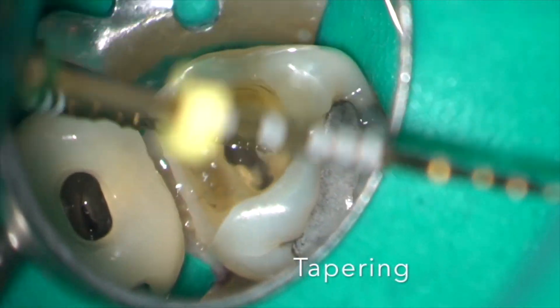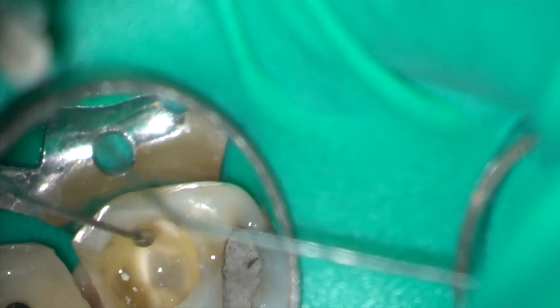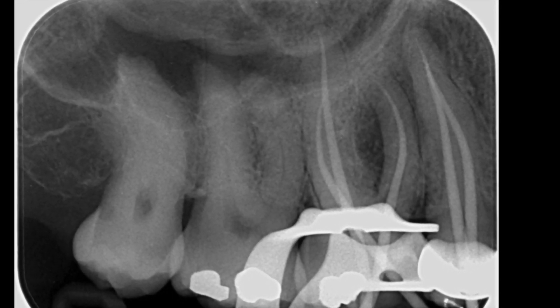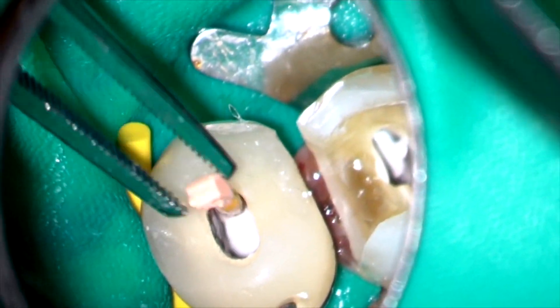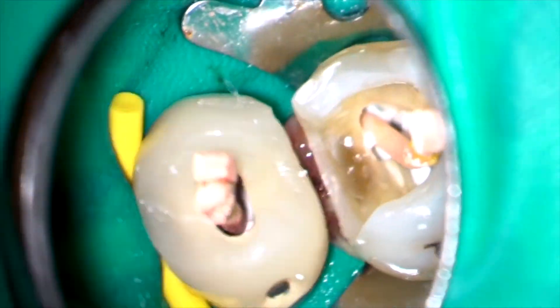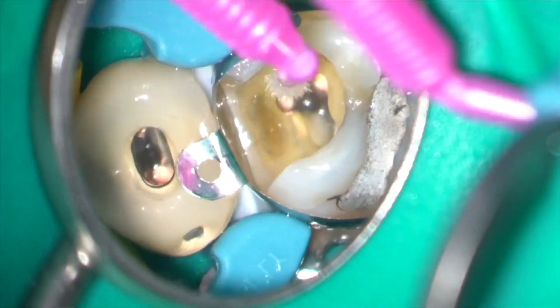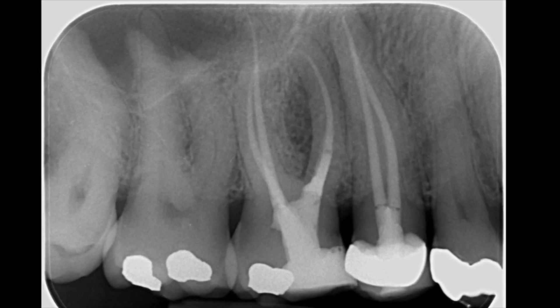This sequence has been speeded up. A cone fit radiograph was exposed prior to obturation using a bioceramic cement and single cone technique. The access cavity was sealed using a dual-cure composite and the palodent matrix system. The final radiograph shows excellent coronal apical seal in these very long root canals.